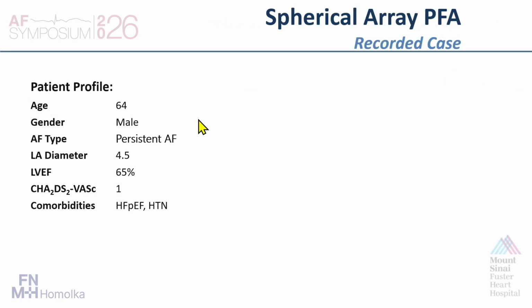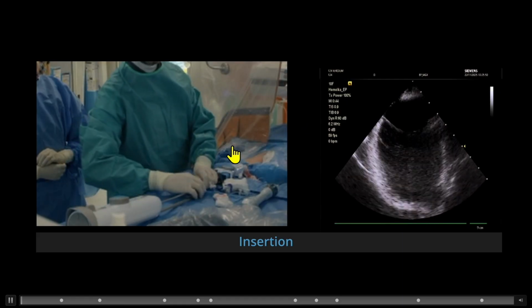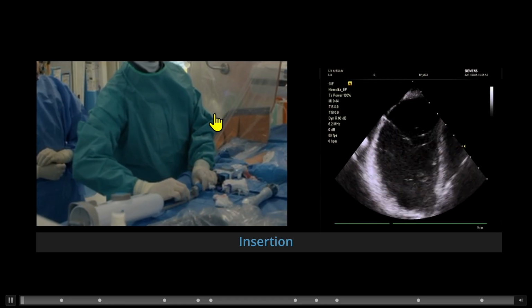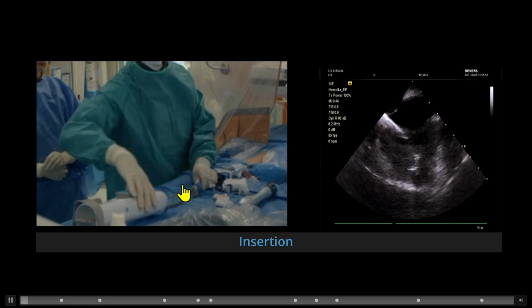So let's just look at the recorded case. It's a 64-year-old male with persistent atrial fibrillation who's planned for an ablation procedure. And this is a protocol in which, in addition to PVI isolation, we also, in this particular case, do linear lesions. First thing is introduction.